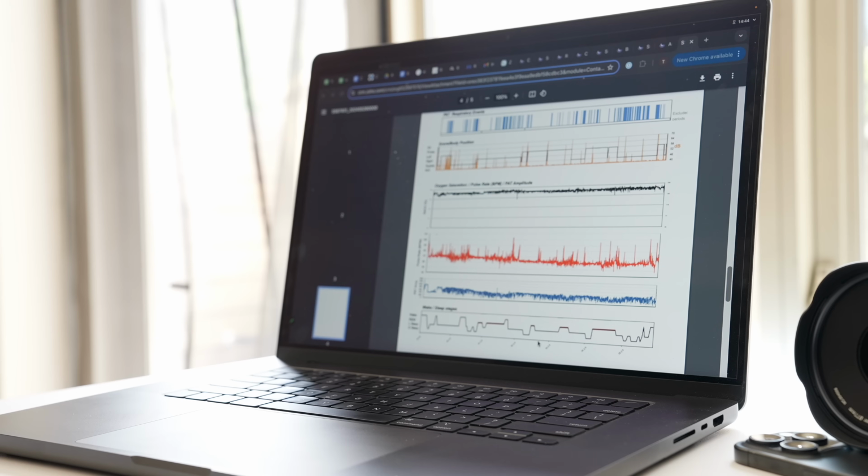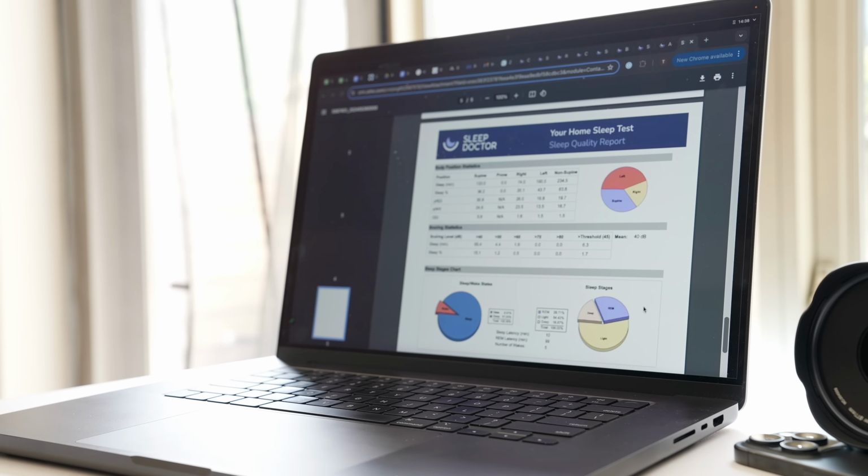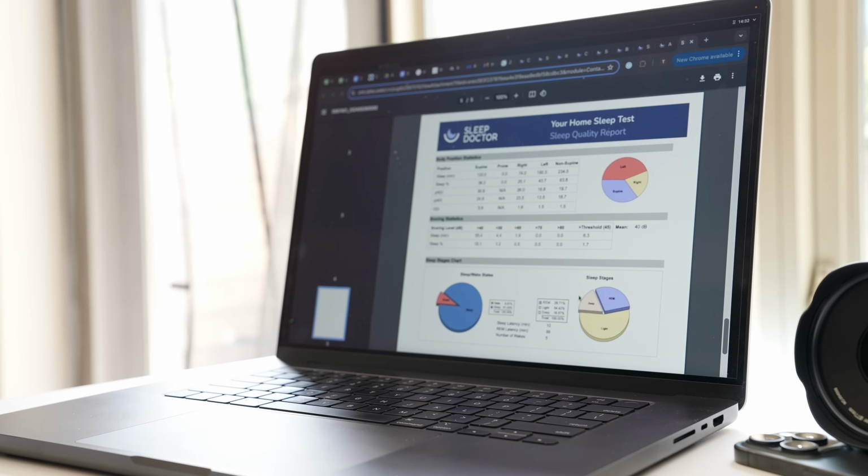Looks like you got all of the stages. You got some deep sleep. You did get REM. Just a little bit choppy up and down, but you definitely got enough REM for what I'm seeing. Let me see how much you got. Yeah, you got plenty of REM. Could have gotten a little bit more of deep sleep though. You got 16.87, and that needs to be about 20 to 25. So you did get a little bit more light sleep. That should have been more of that deep sleep stage, because light sleep needs to be about half.